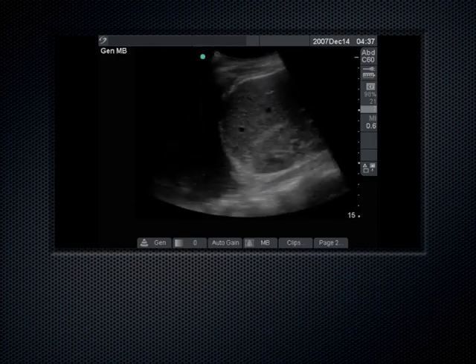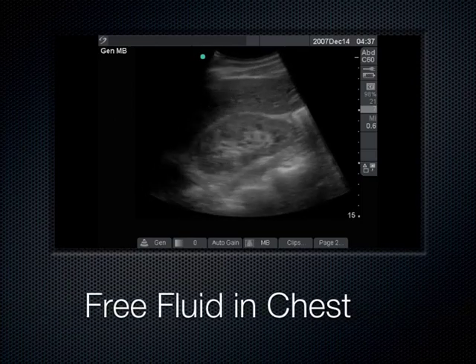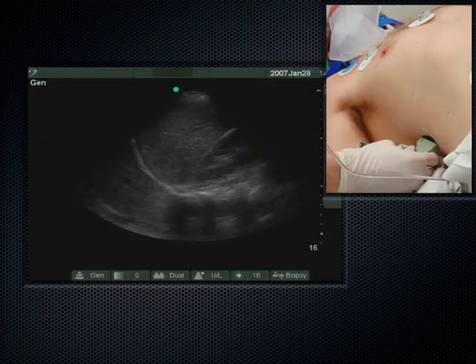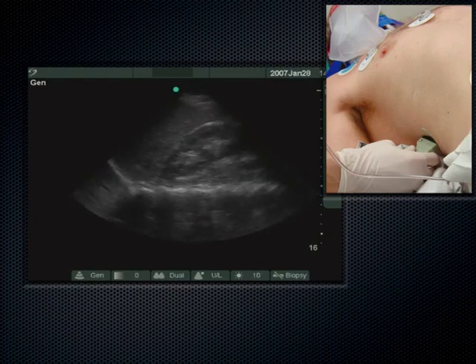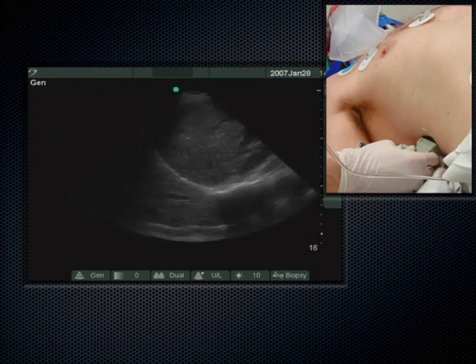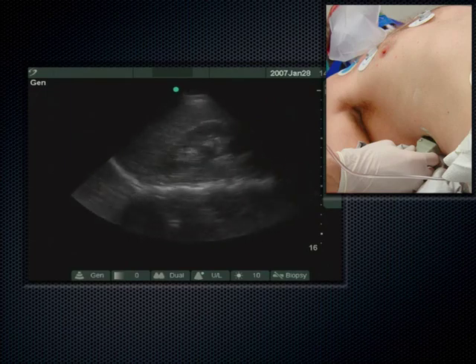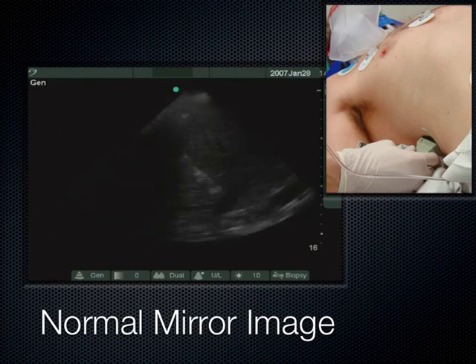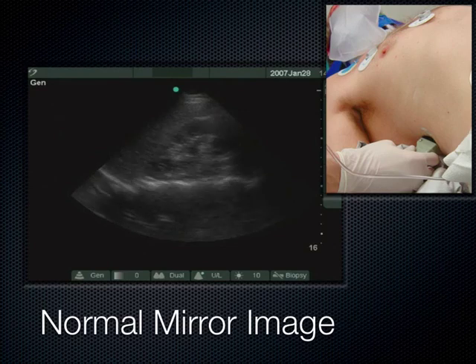By contrast, if you don't have fluid there, air comes down through the liver, bounces off the diaphragm, reverberates, and the probe interprets that there's liver deeper than there is — creating a mirror image of the liver on the other side of the diaphragm. We call this the mirror sign. If you have a mirror image of the liver or spleen on the other side of the diaphragm, that means there was air there at that interface — normal lung was up at the diaphragm. So lack of black above the diaphragm is usually air and that's normal.